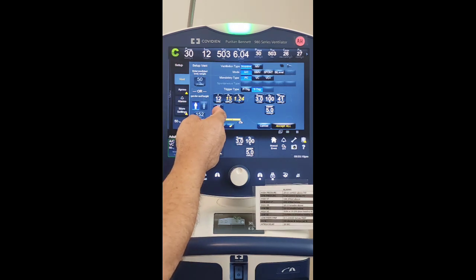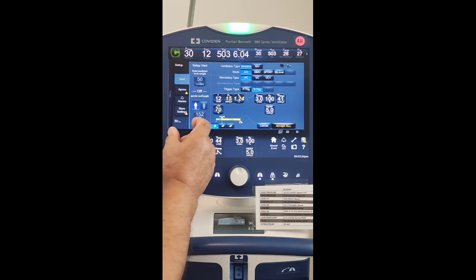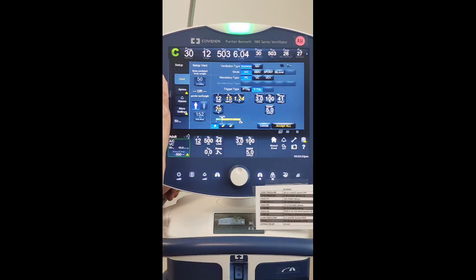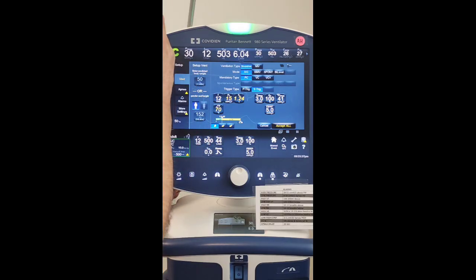And what that is, is how quickly the pressure is reached within the I time window, within the 1.24 seconds. The higher the slope, the quicker it's going to go in.